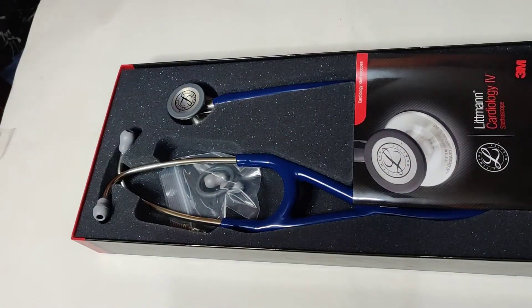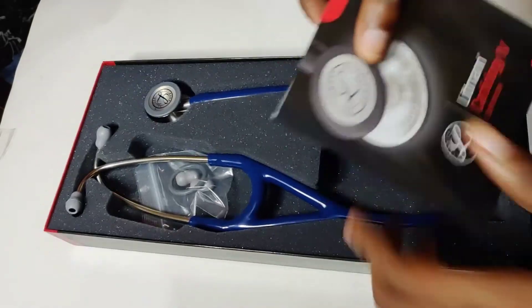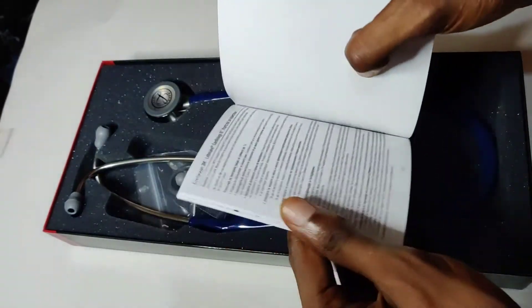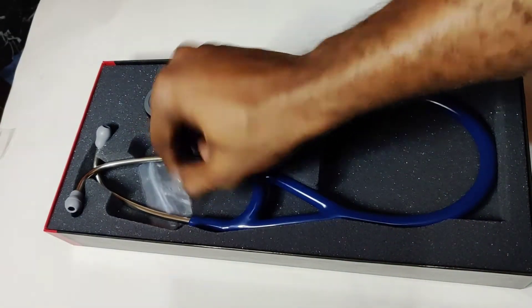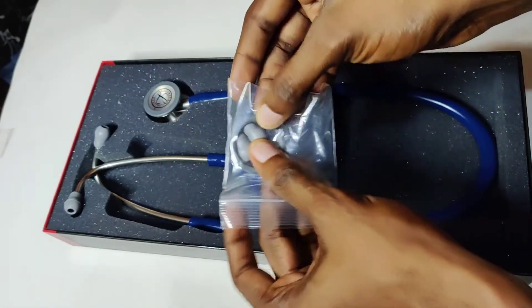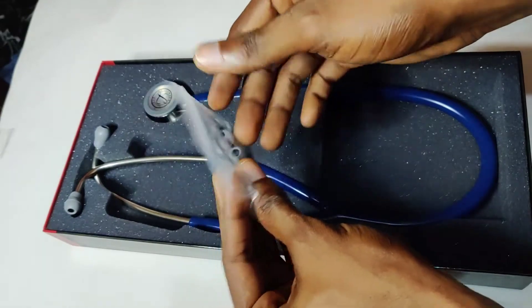This is what we have in the box. We have the user's manual — it comes in different languages as you can see. And here we have the ear tips and also the ring for the bell, as you can see here.